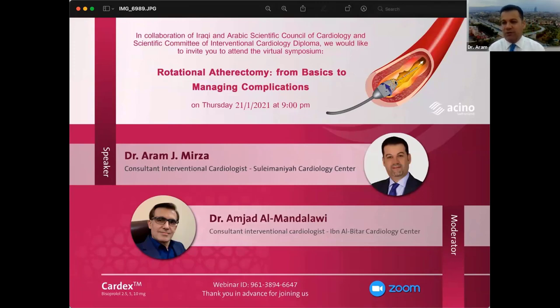You will never get a good expansion of the stent. My advice, if you have a circular calcium, never do rotational atherectomy, because you'll never dilate the lesion. And I think this is the perfect case for shockwave lithotripsy, when you have a circumferential calcium.